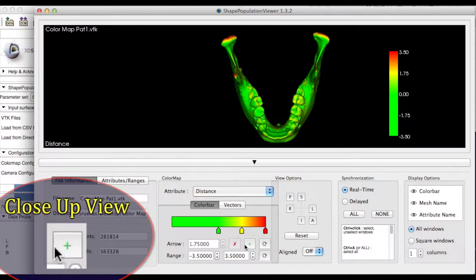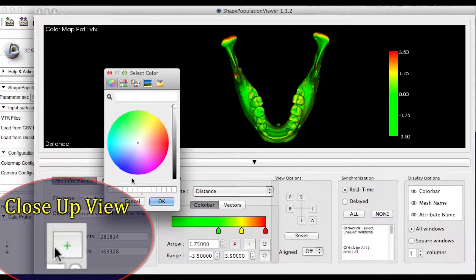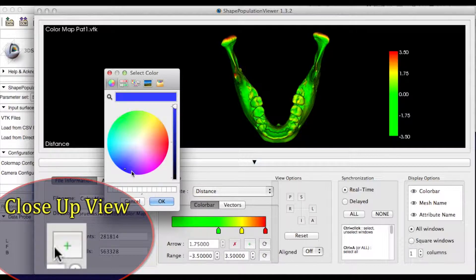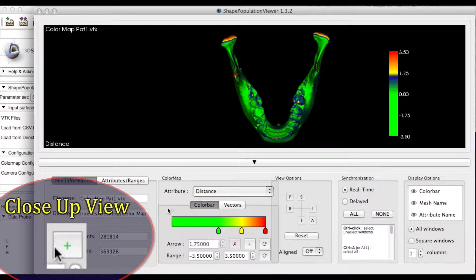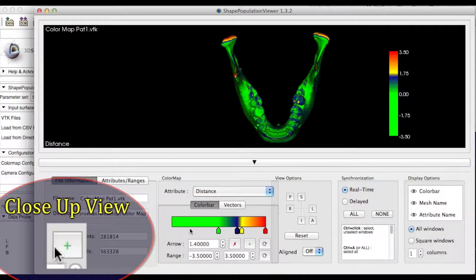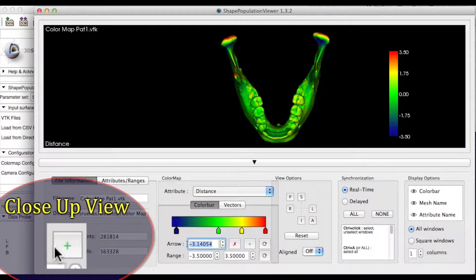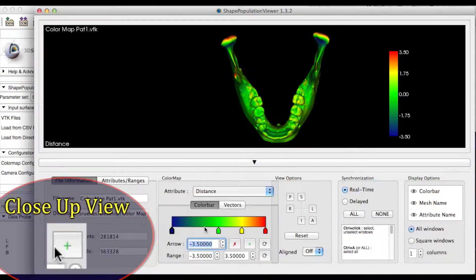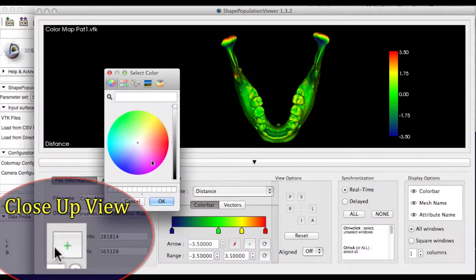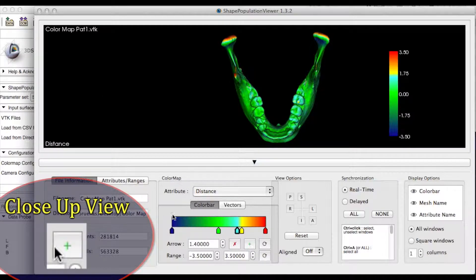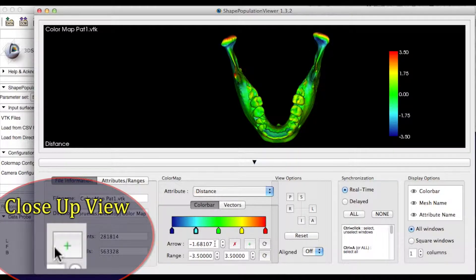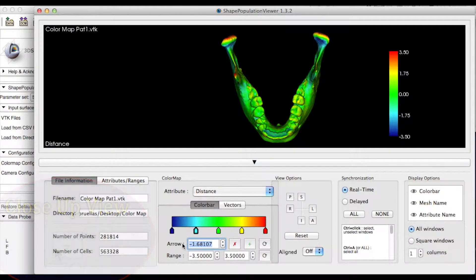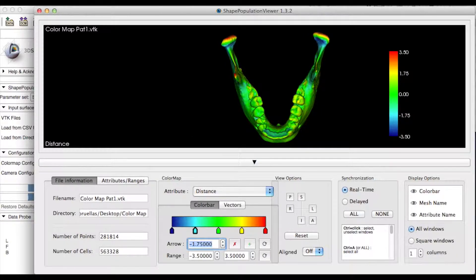You can add arrows, which correspond to new colors, allowing you to see more differences with other color changes. For example, here we add dark blue on the opposite side of red, set at negative 3.5 millimeters. These blue colors will display inward change, or a negative value of the mean surface distance. We added a light blue, set at negative 1.75 as a midpoint.